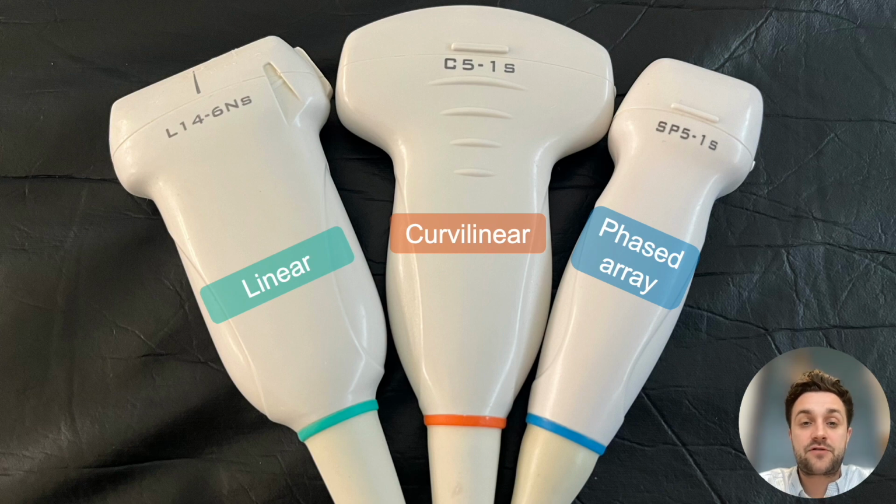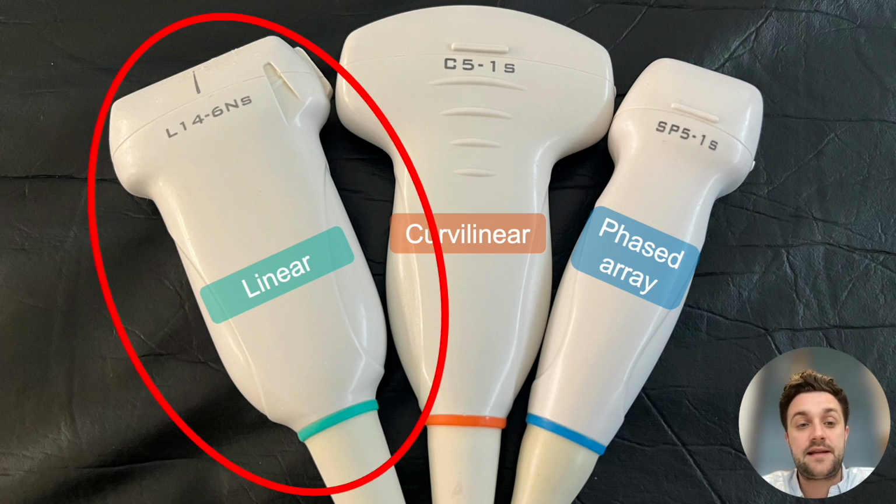You may have seen some ultrasounds before, but you may have noticed there's 3 different types of probes on the ultrasound, and we're going to be interested in the linear probe. It is a high frequency probe and it is good for looking at superficial structures. The curvilinear is typically used for abdominal indications, and the phased array probe is used for cardiac indications and won't be relevant for this course. If you could please note that on the linear probe there is this little line in the middle of the probe, and that will become useful later.